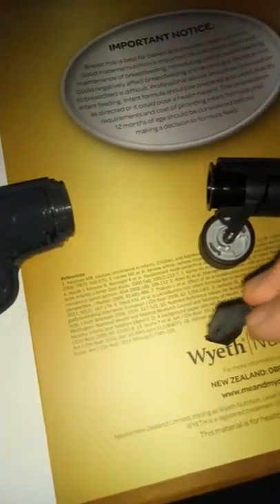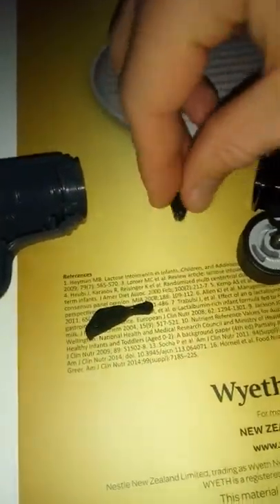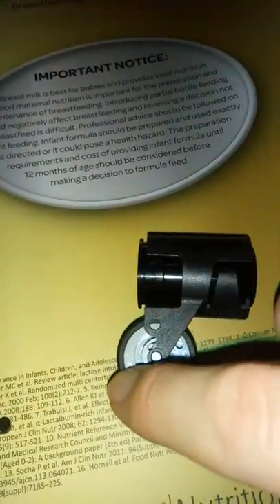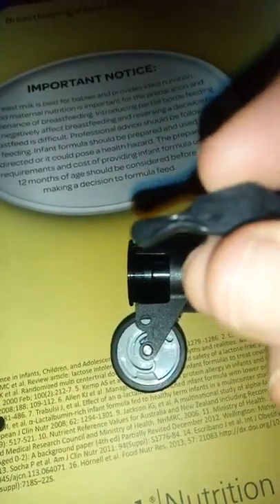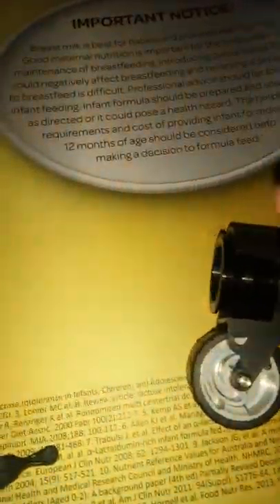And now the difficult part are these two little arms. So they have a little L, which you won't be able to see on the video, and a little R there to tell you left and right, and on here there's a little L for left, and on the opposite side there's a right, so obviously L goes on the L side. So the little thing pointing out goes on the top side, the little point goes in this hole here and pivots there. The longer poking out bit goes in the groove there, and then the knob on the opposite end sits in that groove right there.